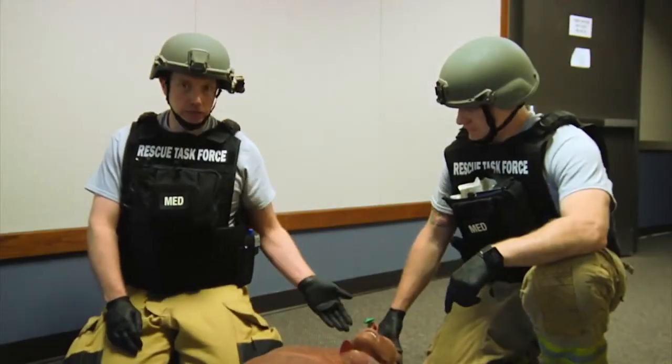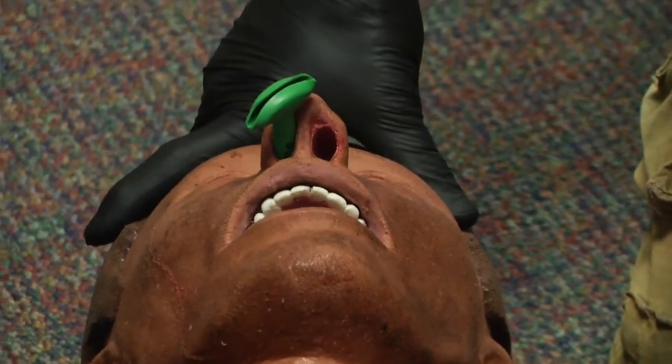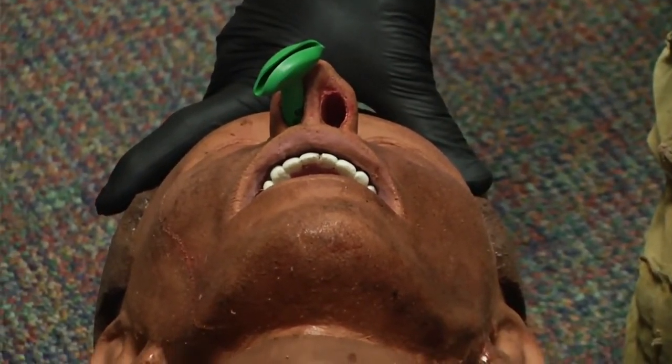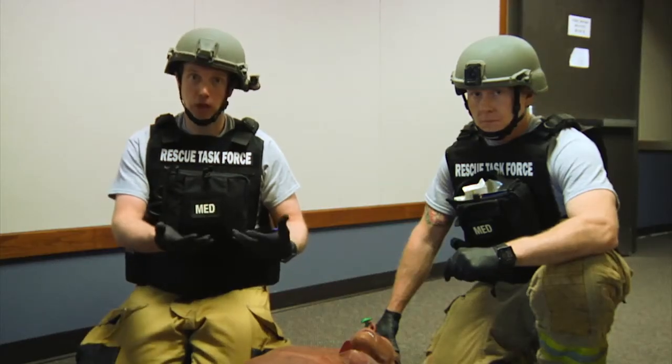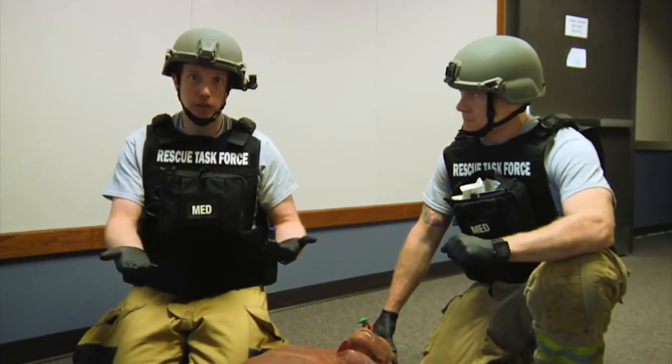Definitive management of this condition will require advanced life support assistance when tactically appropriate. We then applied a nasopharyngeal airway, and then we rolled the patient onto his side in order to allow gravity to let any vomit or blood roll out of his airway so that it can stay open should we need to leave him to go treat another patient.